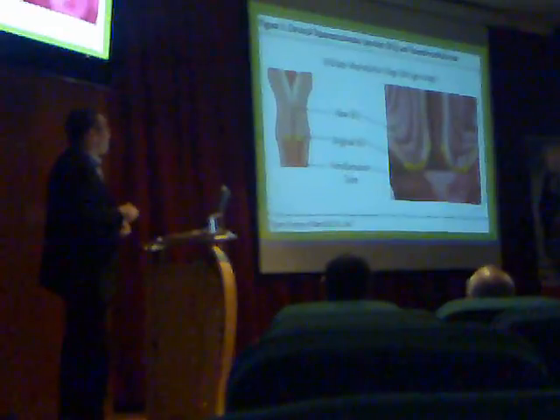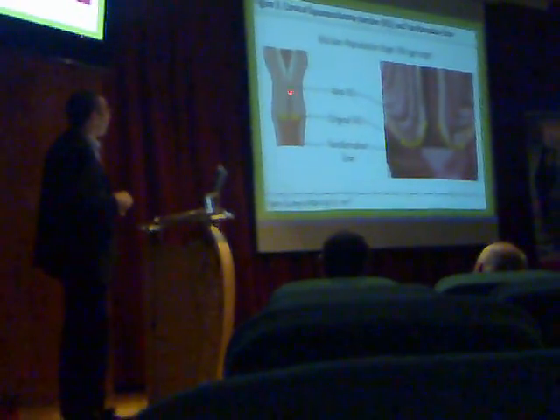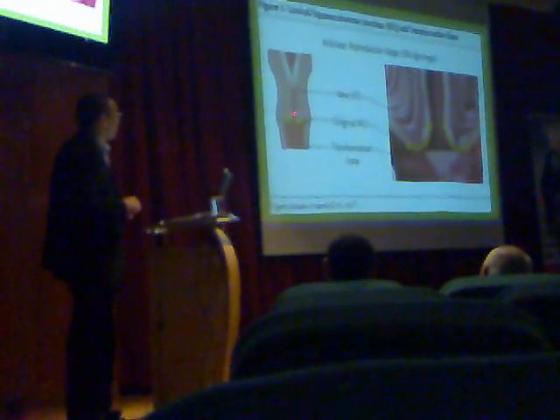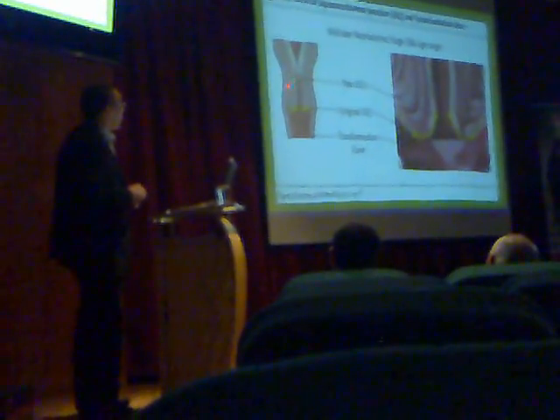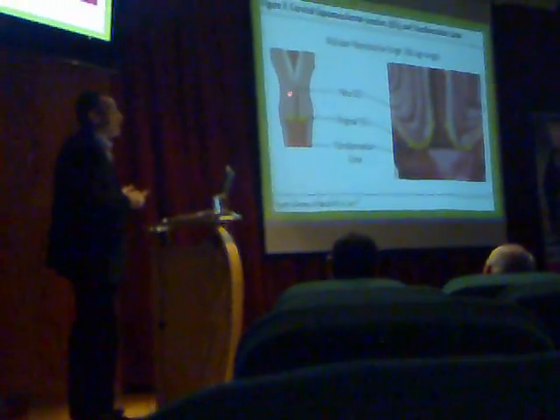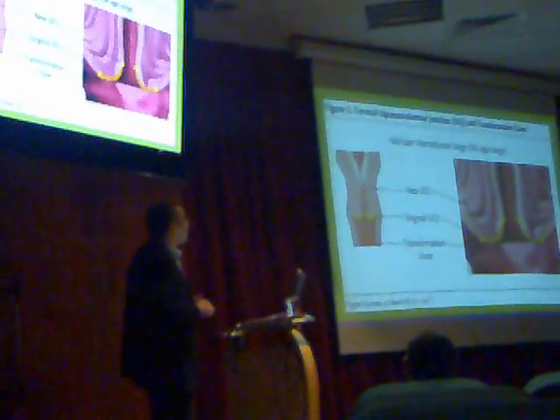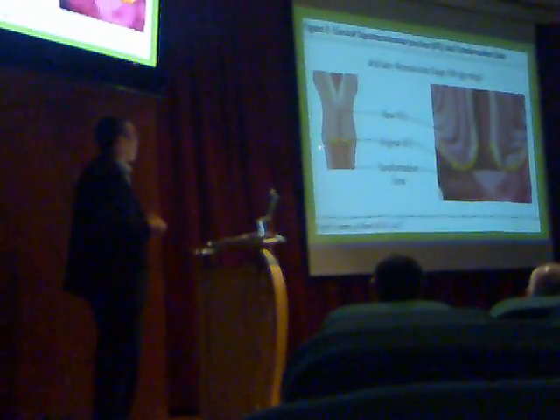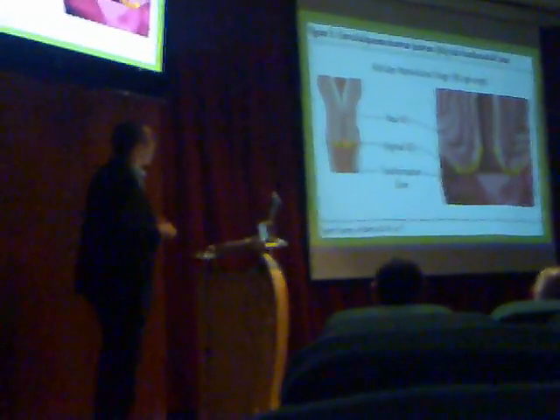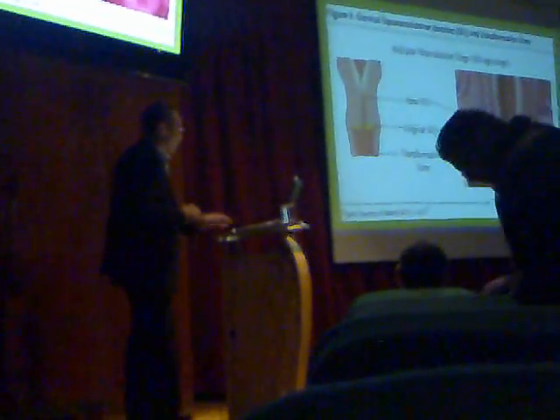Now, you introduce the speculum. Our target of work is the cervix, endocervical and ectocervical. Two samples will be taken. Endocervix, why very important? Because adenocarcinoma has now increased, representing from 10% to 25 to 30% relative to squamous cell carcinoma. Ectocervix, where we concentrate on the squamocolumnar junction and transformation zone.